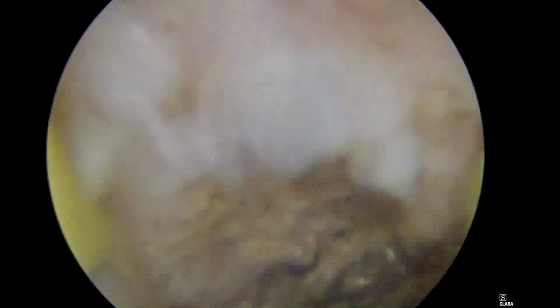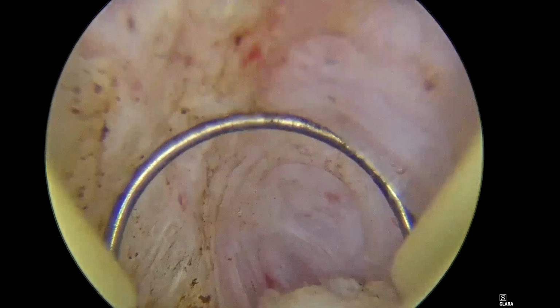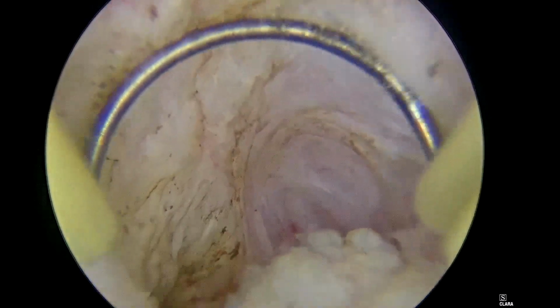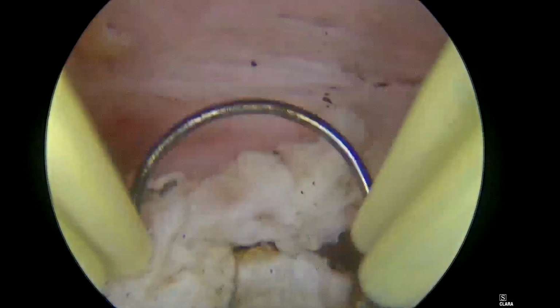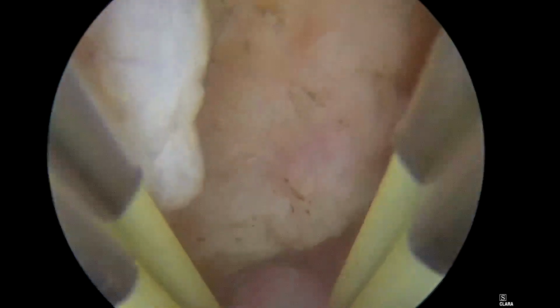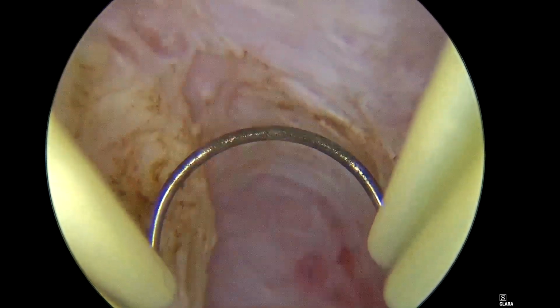You can see here that after some strokes of resection, this is the base, the myometrium, and we have small bleeding vessels. Hemostasis here is just to secure and avoid staining of the distension medium with red blood. Otherwise, you will be operating in red wine or strawberry juice. Once you see this bleeding, you should realize that the intrauterine pressure is less than the vascular pressure. The arterial blood pressure is like 100 or 120. But if you have bleeding, this means you don't have a tamponade effect.